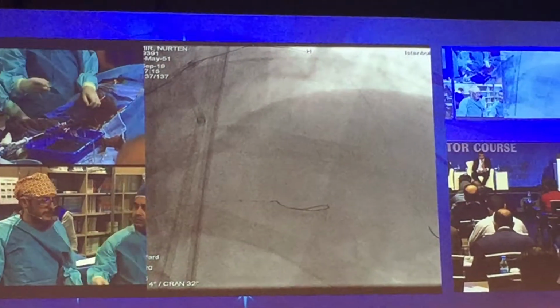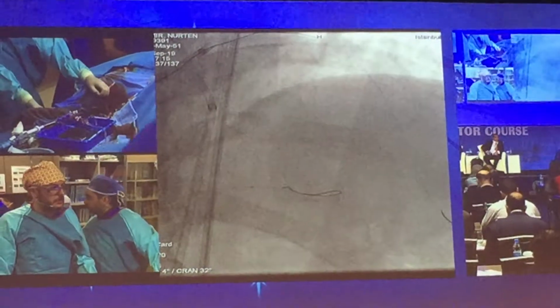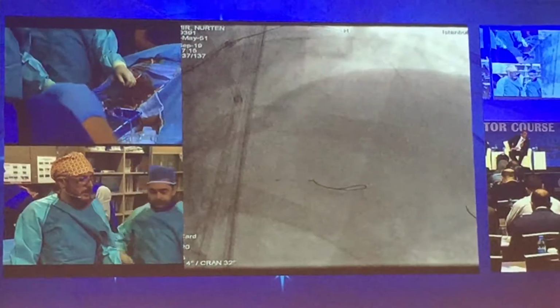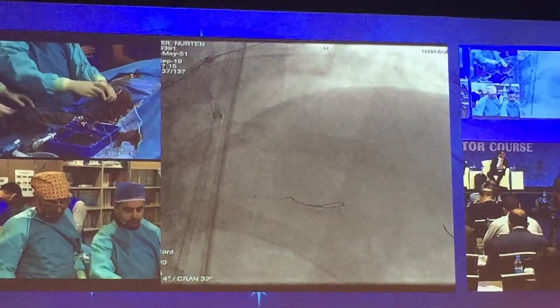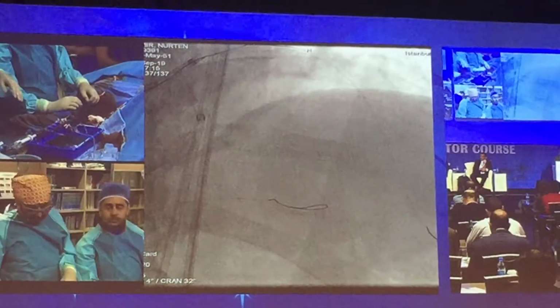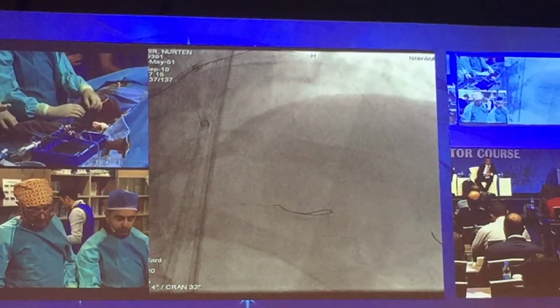Balon please. So what are the options out there for externalization of this long lesion? Which one do you use? Do you use trapping, balloon trapping, or extension wires, or none? Which one is the best, and how often do you use the other techniques? Balloon trapping. This is the more safe.